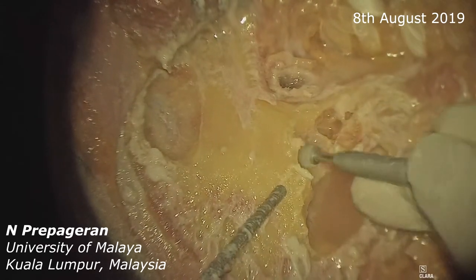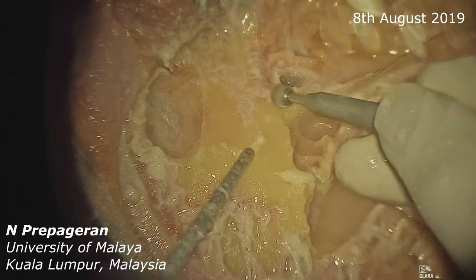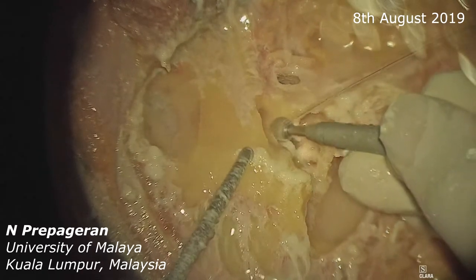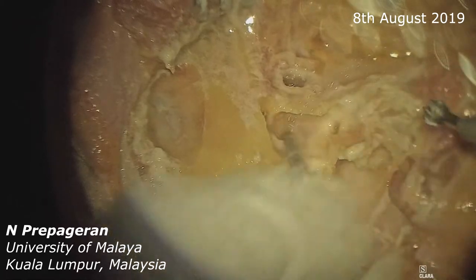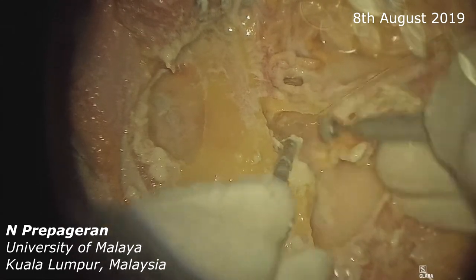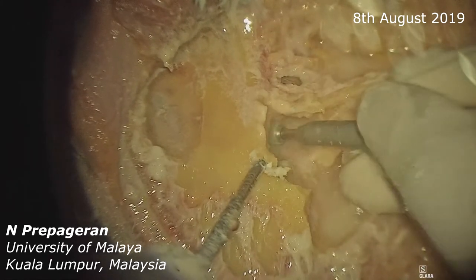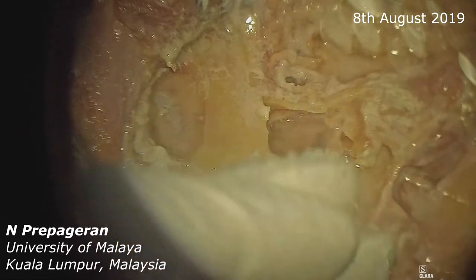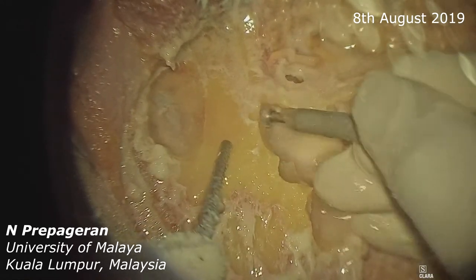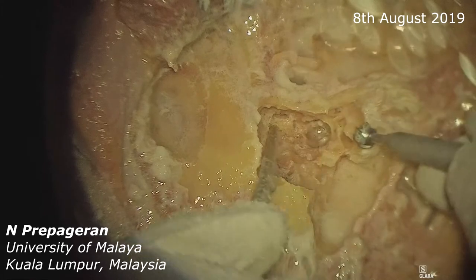So do a cortical mastoidectomy by using the largest cutting burr that we have. When you go slow, you cut substantially. When you go fast, you polish. Try to get the biggest possible burr — the handicap we have is that our biggest possible burr is not really that big. So now we're coming into the mastoid antrum itself, and that's probably coming close to the sigmoid sinus region.